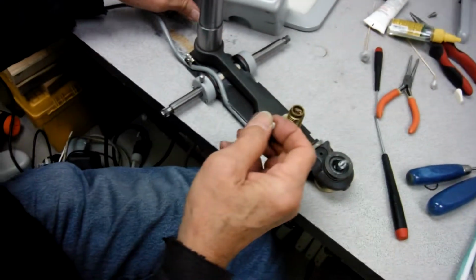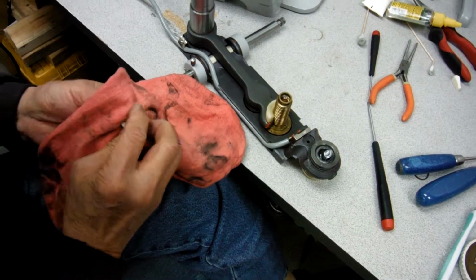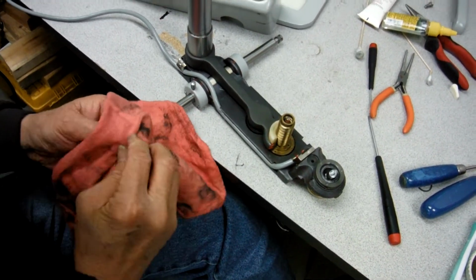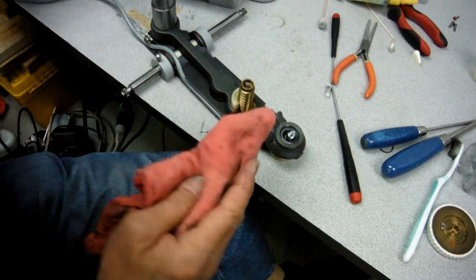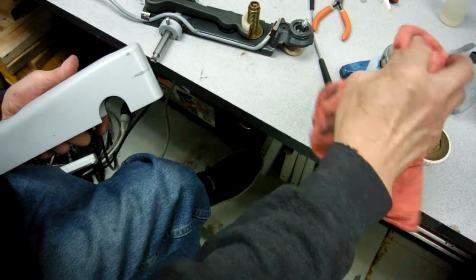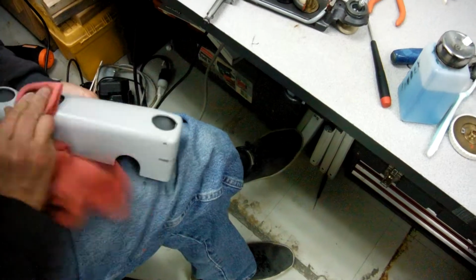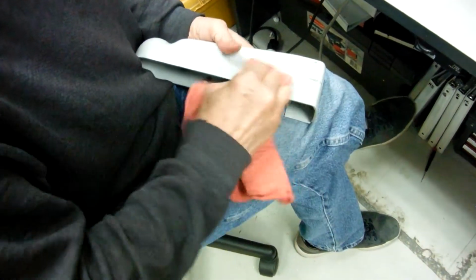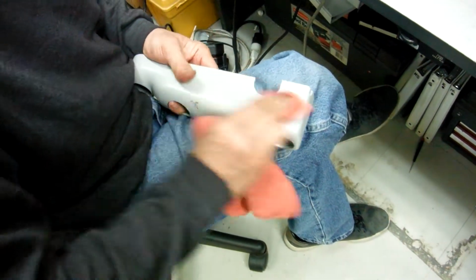So again, the button, if it's dirty, you can clean it. If you feel it's not important, you don't have to clean it. But since you take it apart, might as well just clean everything. Make sure you can use any solution as long as it works for you. But I think Fantastik cleans quicker and better.